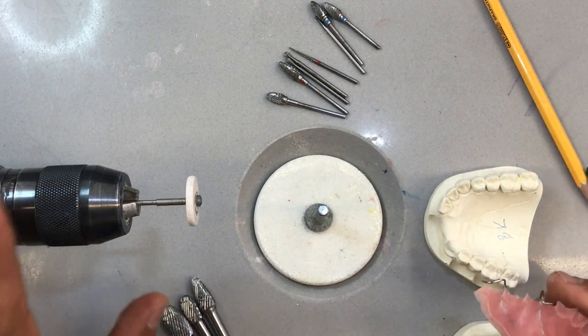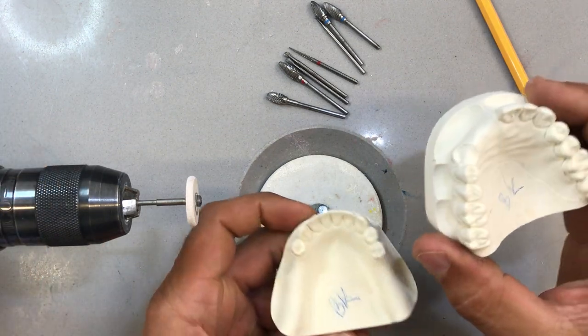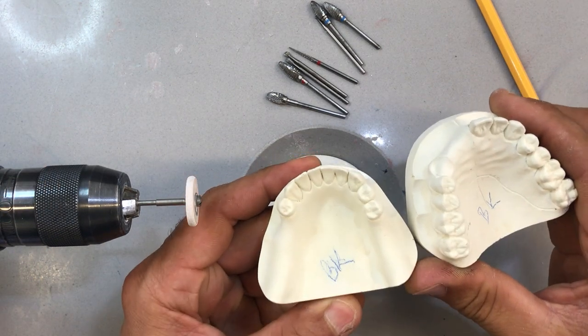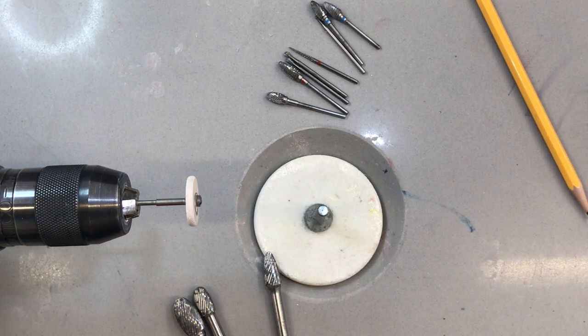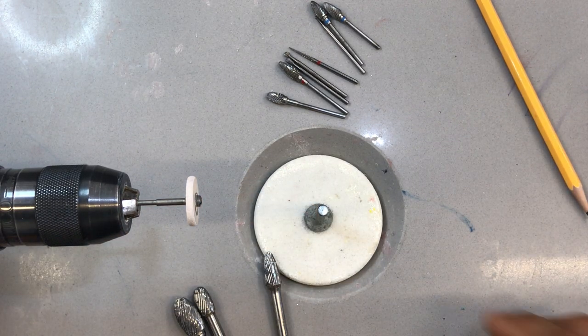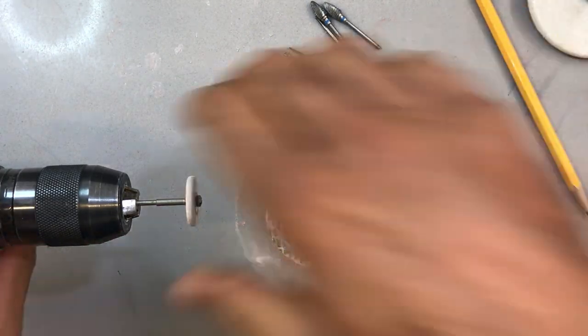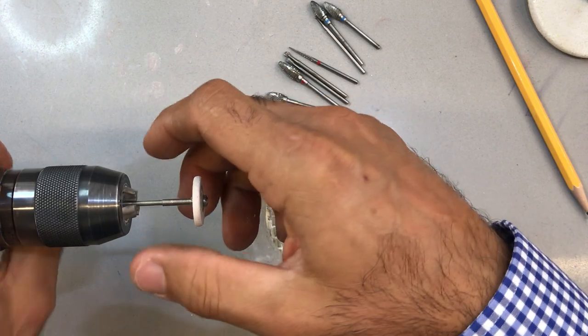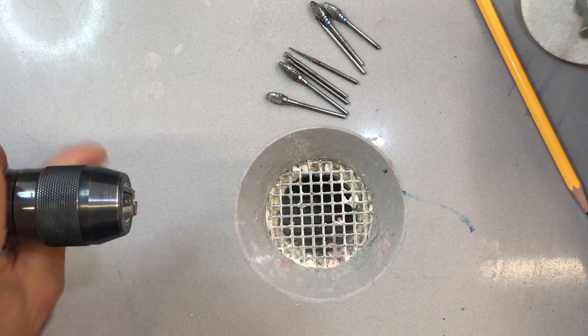I'm going to use my lathe as well as the handpiece to trim the case, rough trim it, and fit it onto my duplicate models. Make sure every time you're grinding something you're wearing eye protection, a mask, and have adequate vacuum.